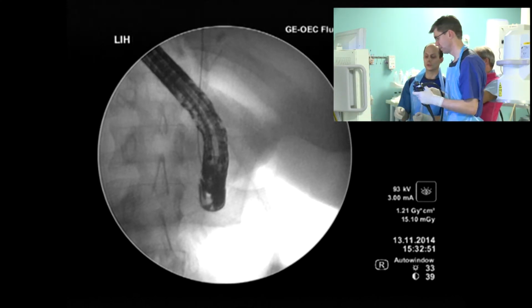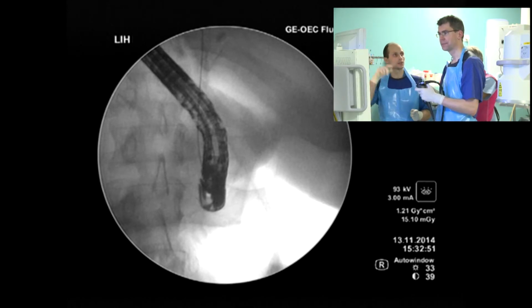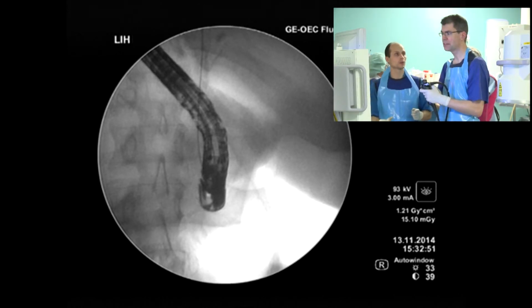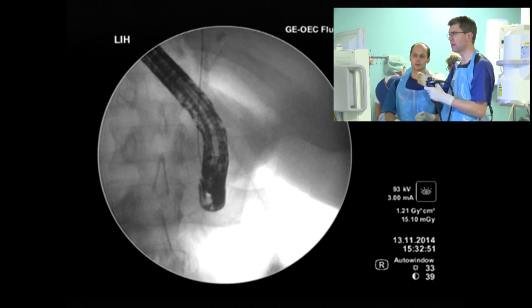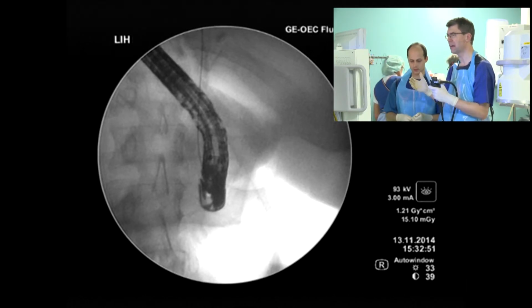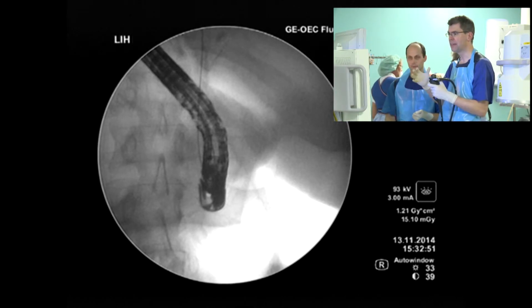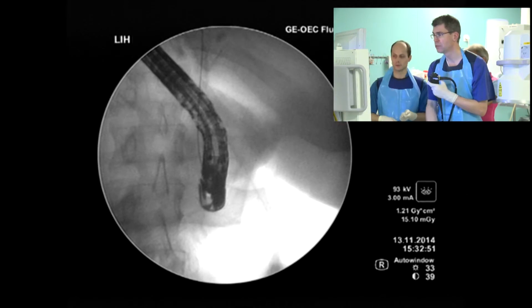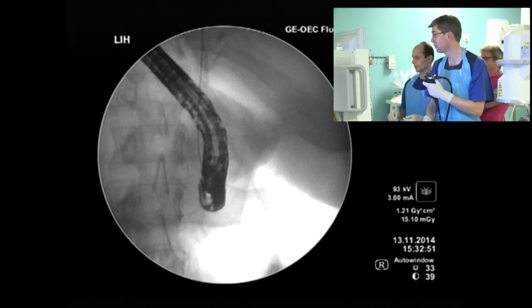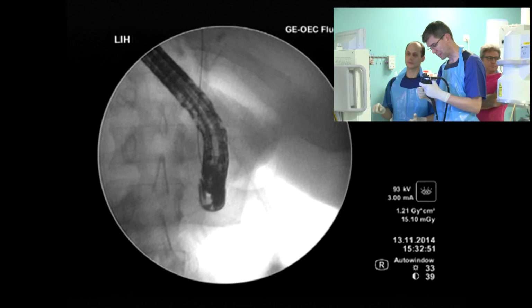So a couple words about the X-ray picture, about these intrahepatic ducts. Right. What can you say? What we've seen is that the intrahepatic ducts are not very long, meaning the expansion of both lobes is not too much, which could be a sign of peripheral atrophy.